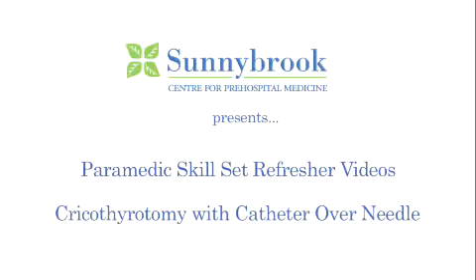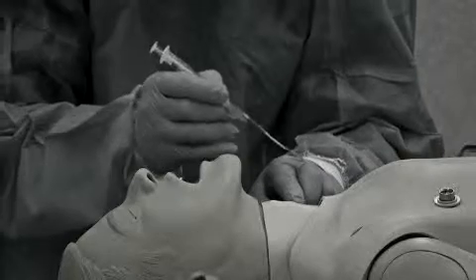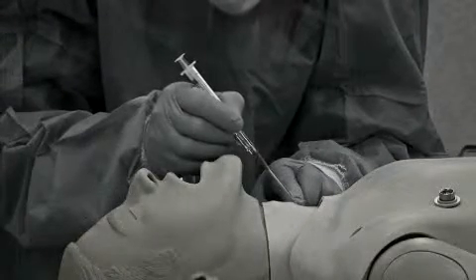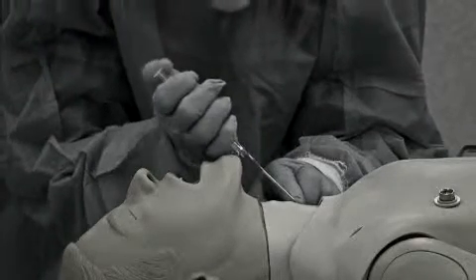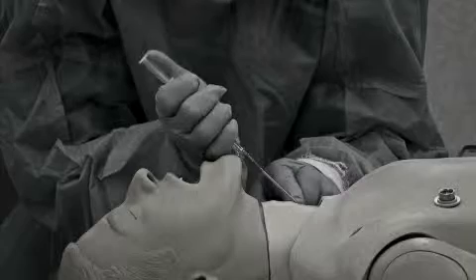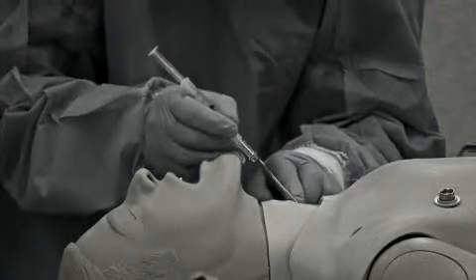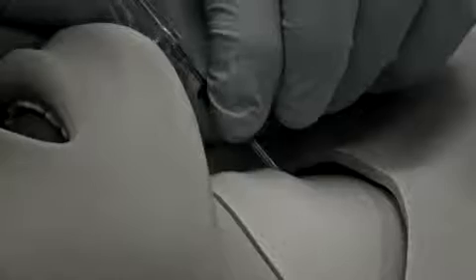Cricothyrotomy with catheter over needle. An advanced care paramedic may perform a needle cricothyrotomy when the following indications are present. There is a need for advanced airway management, and intubation or supraglottic airway insertion is unsuccessful, and you are unable to ventilate the patient. Prior to proceeding with this procedure, you are required to patch for online medical direction.